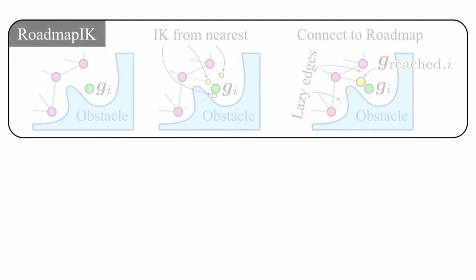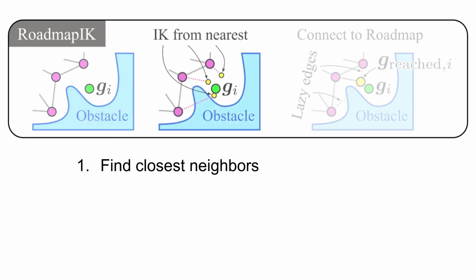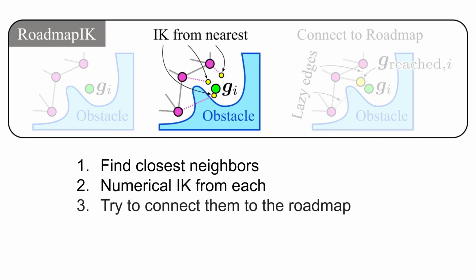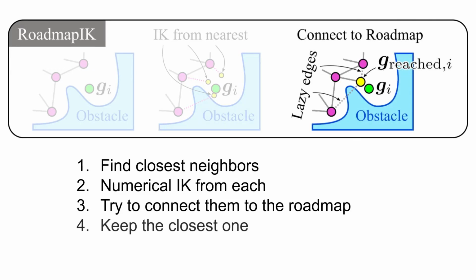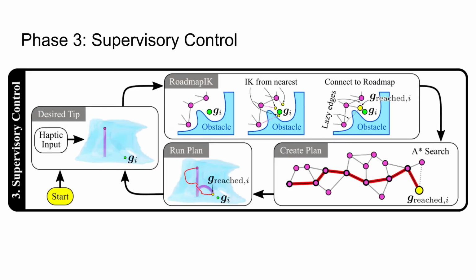Our roadmap-IK algorithm first finds the nearest neighbors in the roadmap to the specified goal tip position, performs numerical inverse kinematics from each one, attempting to connect them to the roadmap. We keep the connection closest to the goal tip position and add additional lazy edges to nearby configurations. Having connected this found goal configuration to the roadmap, we generate a plan over the graph using the optimal and efficient A-star search algorithm. The plan is executed and we wait for the next desired goal position.